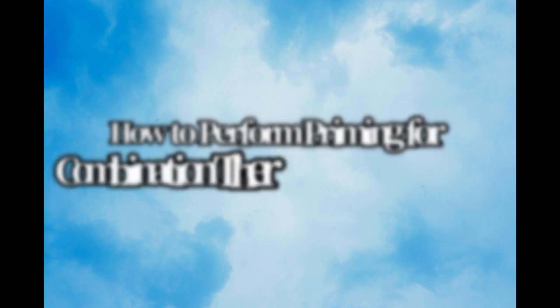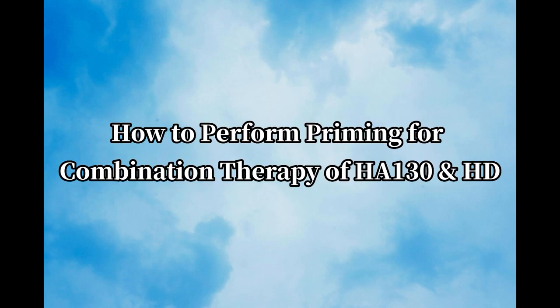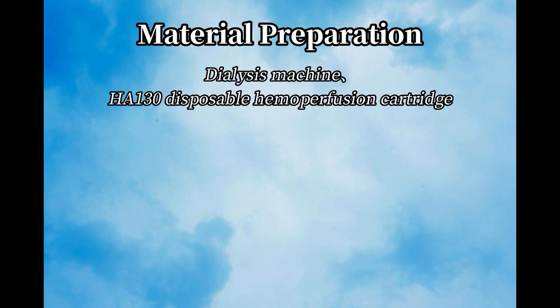How to perform priming for combination therapy of HA-130 and hemodialysis. Material Preparation: Dialysis Machine. HA-130 disposable hemoperfusion cartridge.